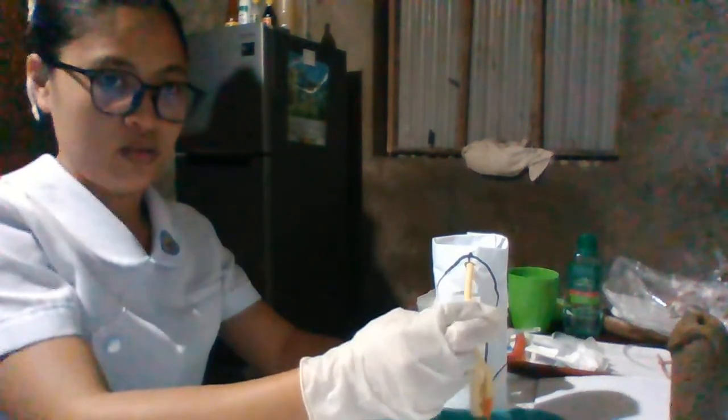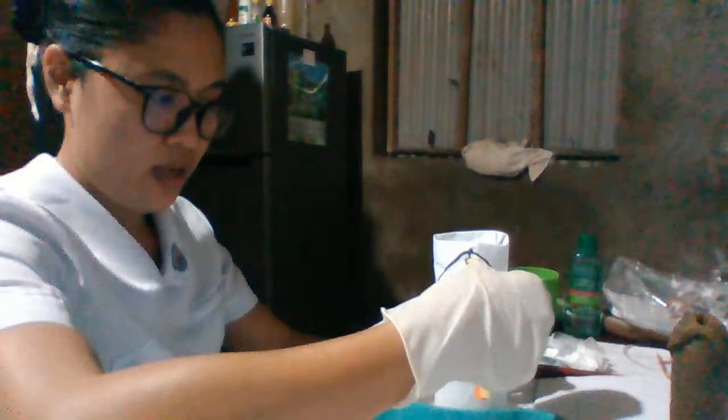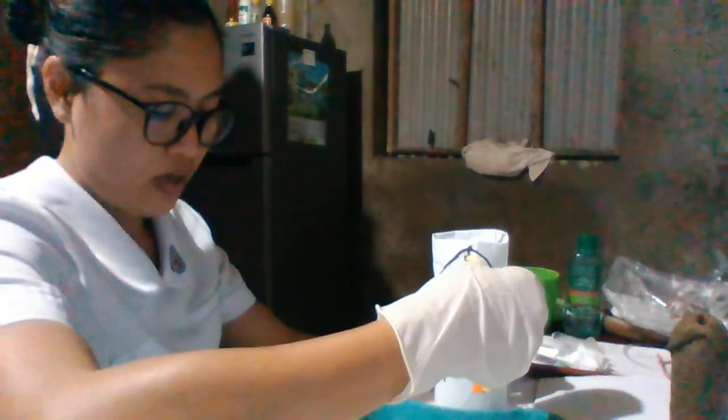Then if we gather the needed amount, we just pinch the catheter to stop the urine drain.